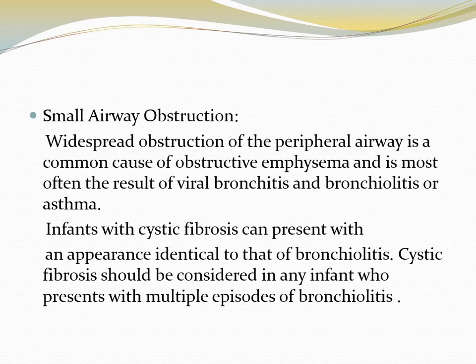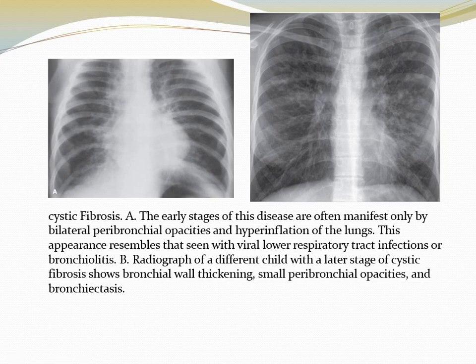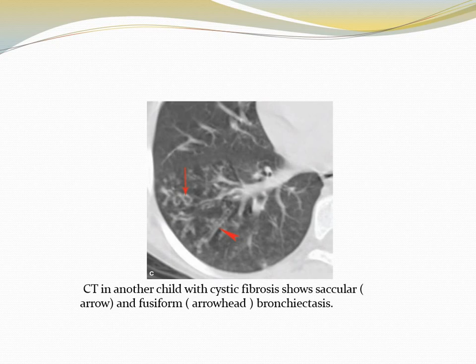Small airway obstruction causing widespread obstruction of the peripheral airway is a common cause of obstructive emphysema, most often the result of viral bronchitis and bronchiolitis or asthma. Infants with cystic fibrosis can present with an appearance identical to that of bronchiolitis. Cystic fibrosis should be considered in any infant who presents with multiple episodes of bronchiolitis. In this case of cystic fibrosis, there are bilateral peribronchial opacities and hyperinflation of the lungs. In a later stage, CT shows thickening of the bronchi, small peribronchial opacities, and bronchiectatic changes — saccular and fusiform bronchiectatic changes on axial sections.